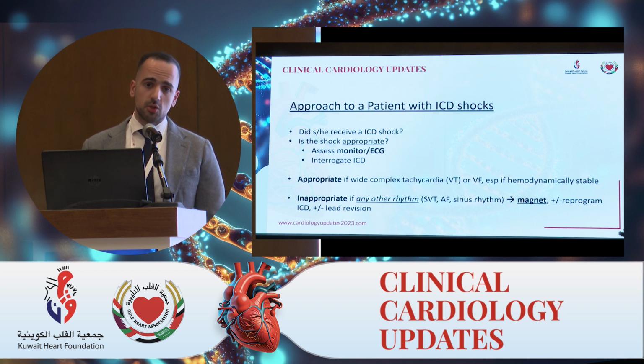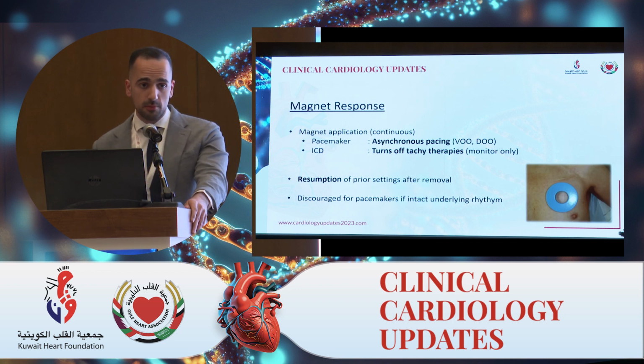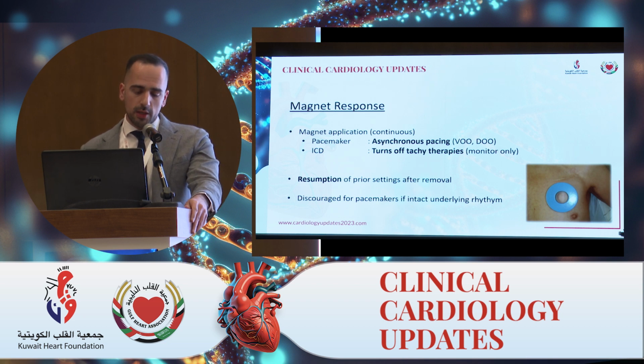However, in certain situations, the patient's getting shocked right in front of you, you need to do something fast. In that situation, that's where a magnet will come in handy. The magnet response is an excellent feature programmed in all pacemakers and defibrillators, which allows the quick ability to alter one thing about these devices purely by the presence of a magnet over the generator. The device will sense this and alter one of its functions. This effect differs in a pacemaker and a defibrillator.